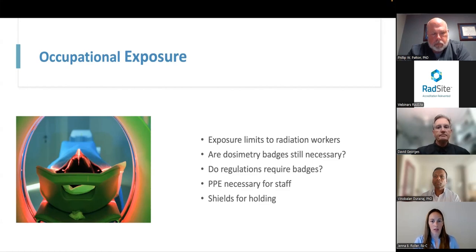And we work so that it is either nearby and protected, or we have a number of rooms, to be compliant with their state regulations, where there is a wing wall or some other installed barrier that protects the operator where they're using the exposure button controls.